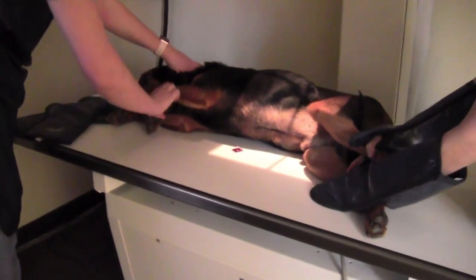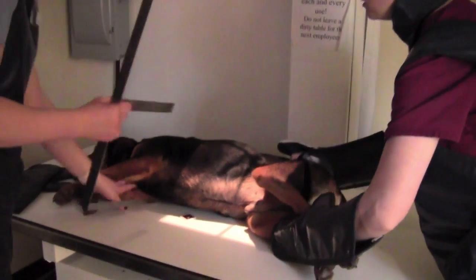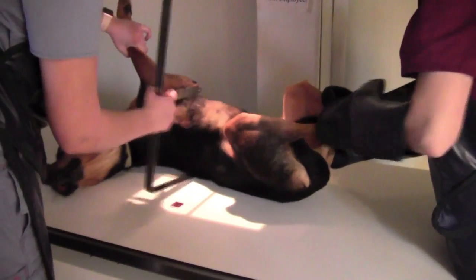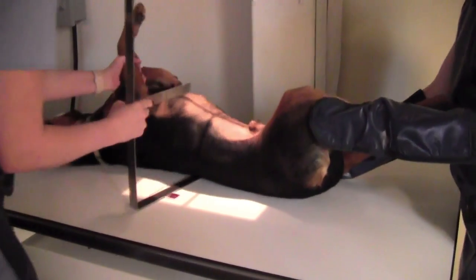After inputting all the patient's information into the computer and selecting ventrodorsal abdomen, I will then measure the patient at the caudal aspect of the 13th rib, about the level of the umbilicus.